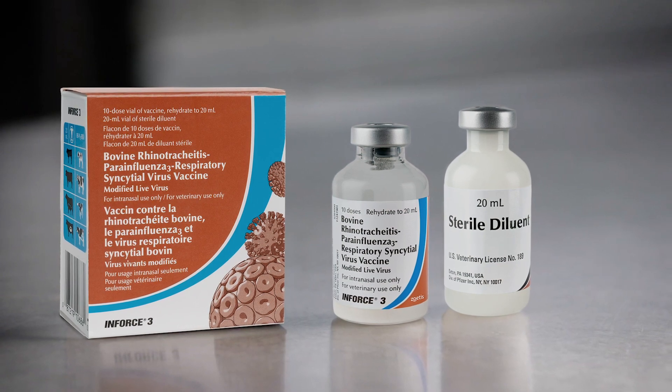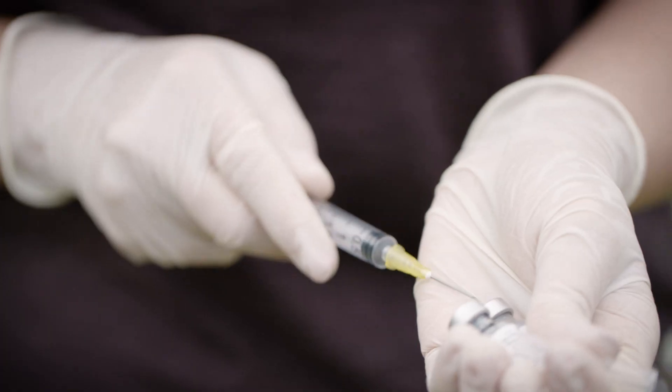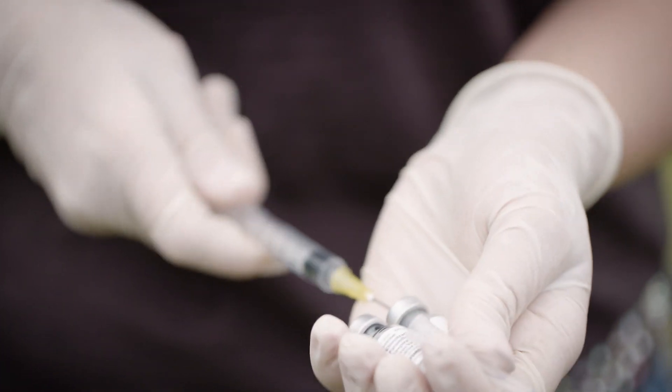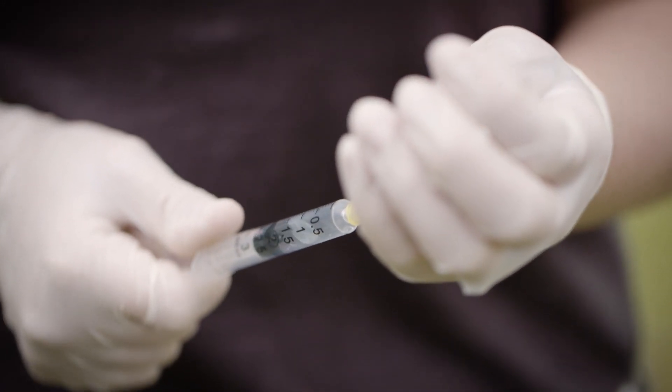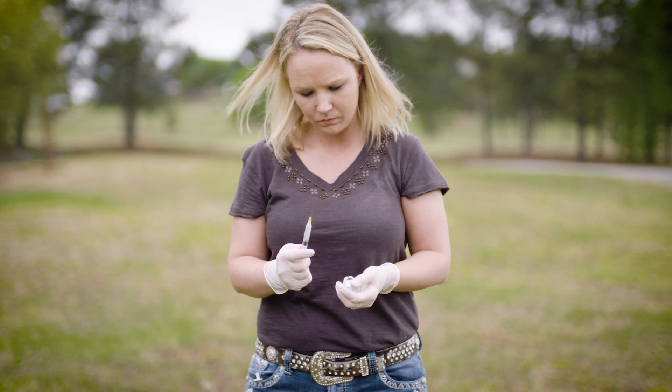Let's begin with a syringe and vaccine that has been mixed according to the label instructions. Insert the needle into the rubber stopper of the mixed vaccine bottle. Fill the syringe with vaccine. Remove the needle from the syringe and replace with a cannula.